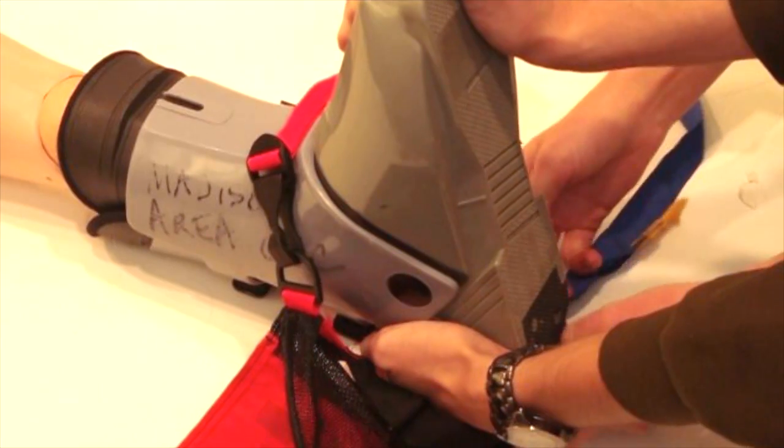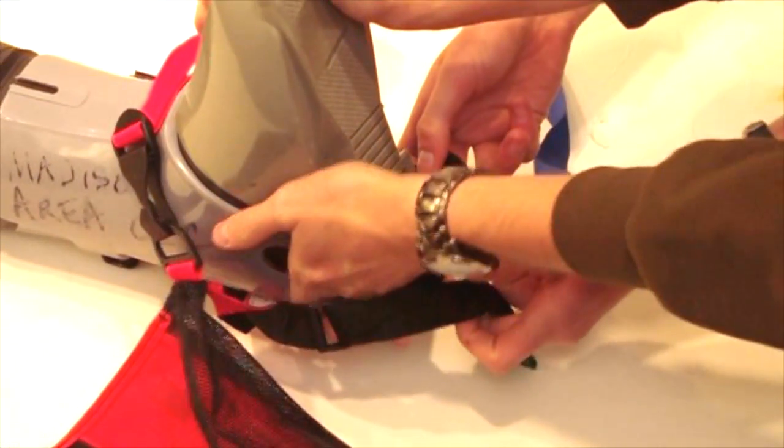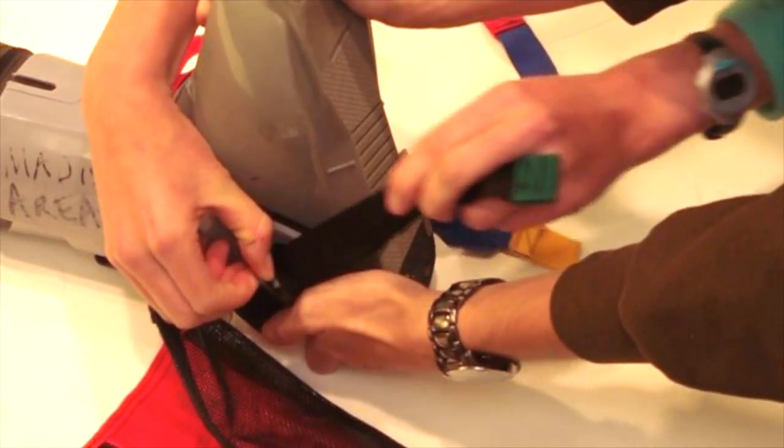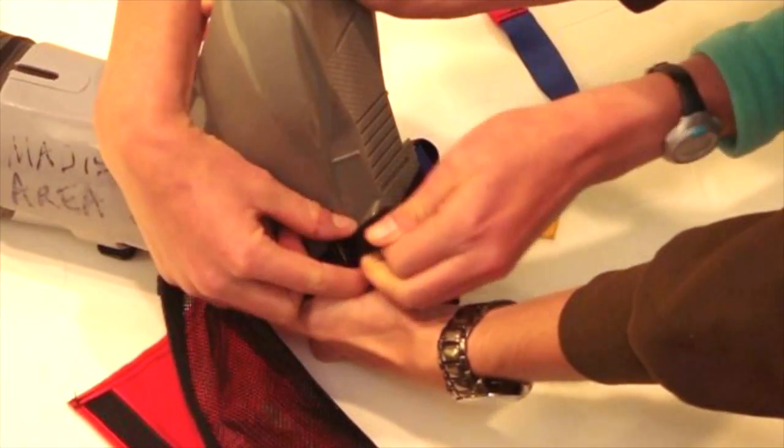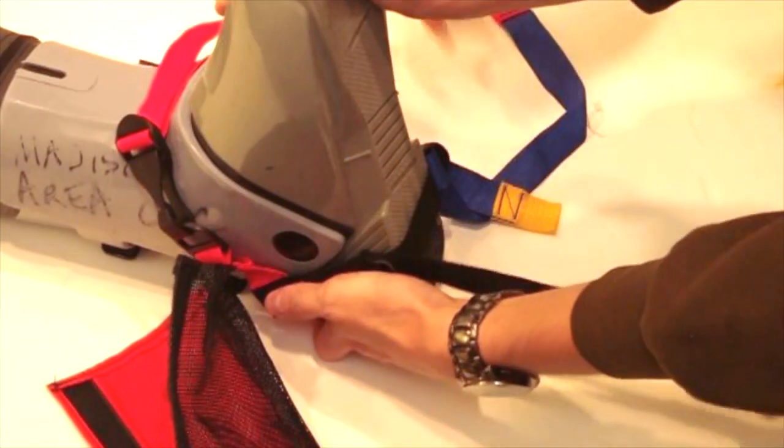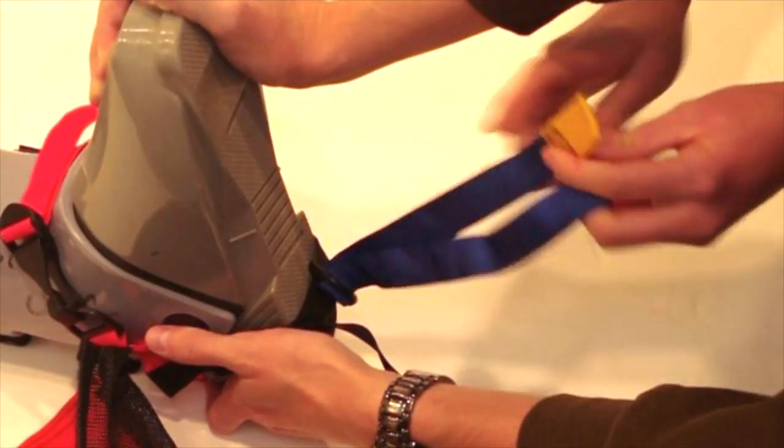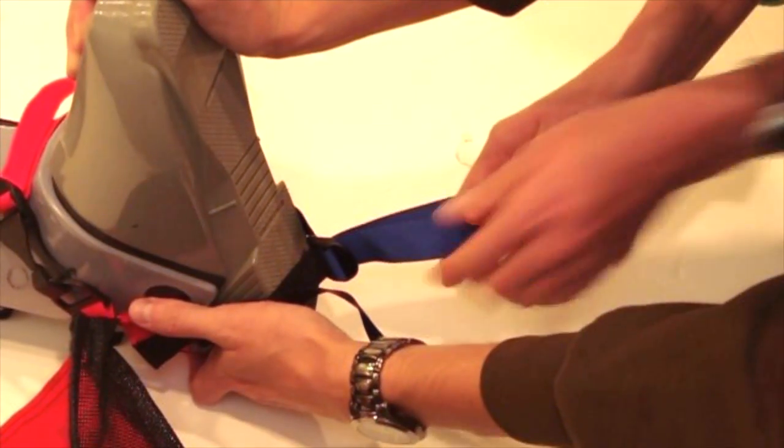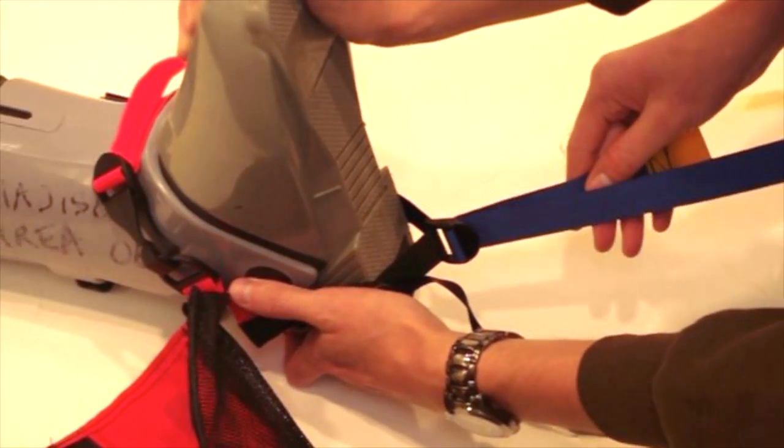The black strap comes up under the instep and is tightened, leaving the blue strap to be set so that the yellow end can be hooked onto the Kendrick device, and the orange end can be used to tighten and take tension.